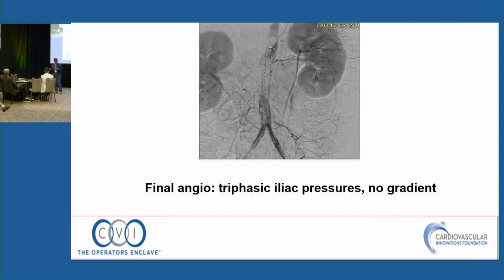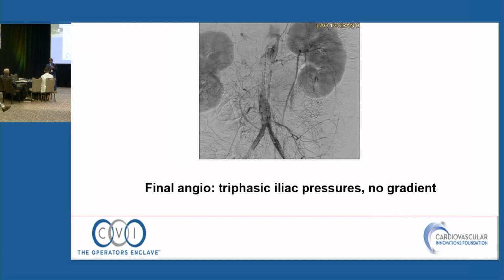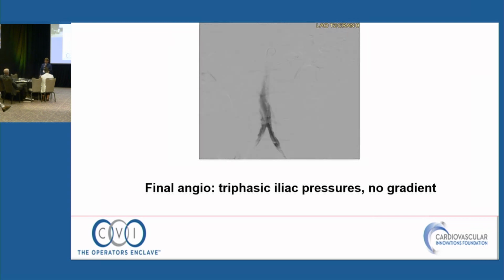I can tell you honestly, everybody said, oh, when I saw him in follow-up, he was great. He really was doing great in follow-up. It's only 3 months. So even if we're going to stent it, it's not going to be stented now, you know, and I think that's the point.